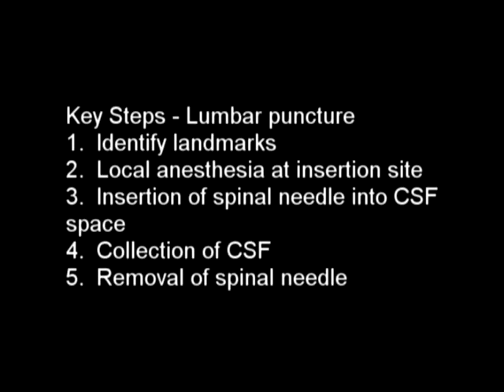Key steps: lumbar puncture, identification of landmarks, local anesthesia at the insertion site, insertion of spinal needle into cerebrospinal fluid space, collection of cerebrospinal fluid, removal of spinal needle.